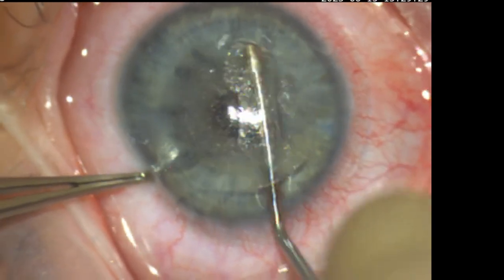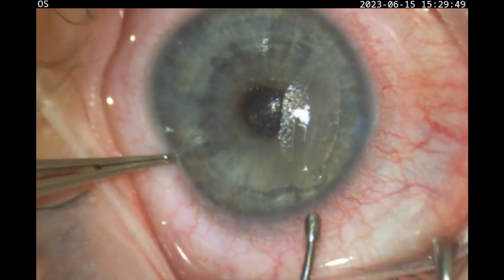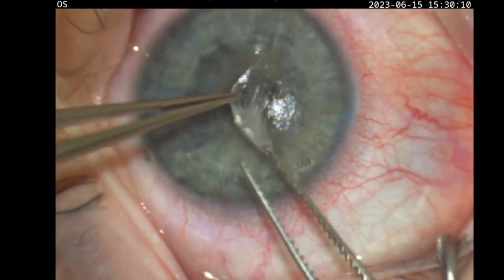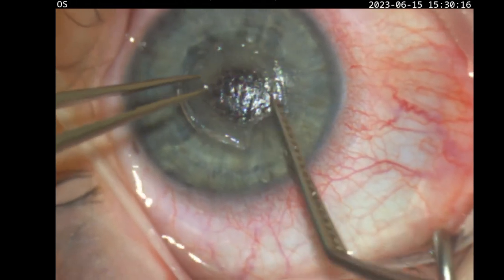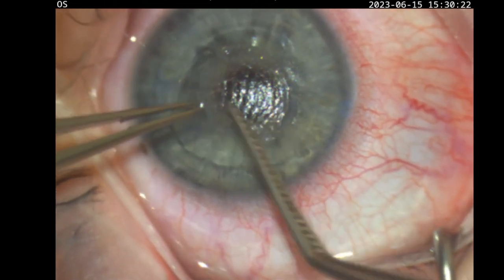At that point the lenticule is free and can be gently removed. It is invariably intact as there is no edge cut, and thus the risk of tears is negligible.